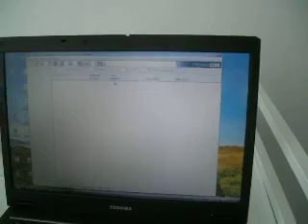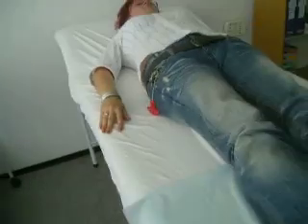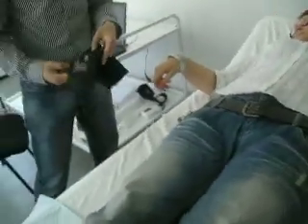Just click OK here. The patient data saves successfully to the database, and now you have this newly registered patient as the default patient. If I would like to start the measurement now, I put on the cuff to the patient. So I always use the suggested cuff size.